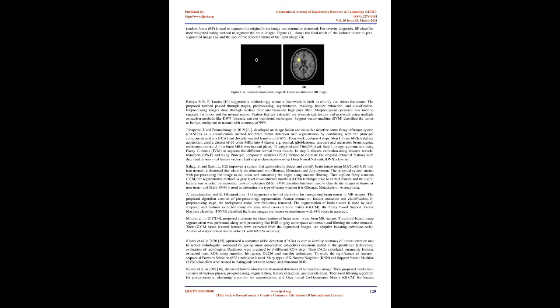To recognize forms and features indicative of tumors and other disorders, computerized algorithms are used. In concept, there is a similarity between biomedical image processing and signal processing. They are similar in terms of enhancement, analysis, and displaying images taken by nuclear medicine, ultrasound, X-ray, MRI, and optical imaging technologies.